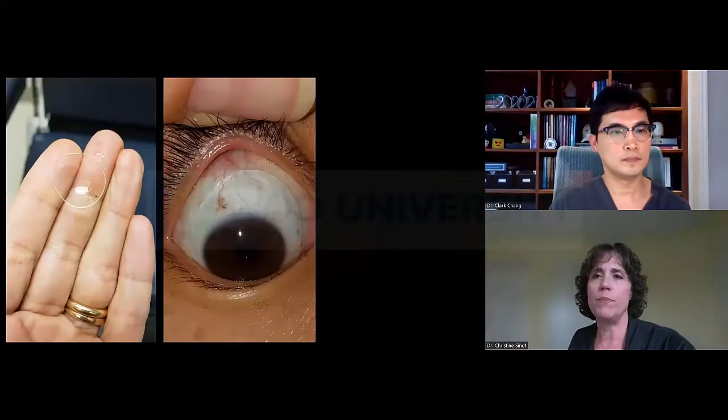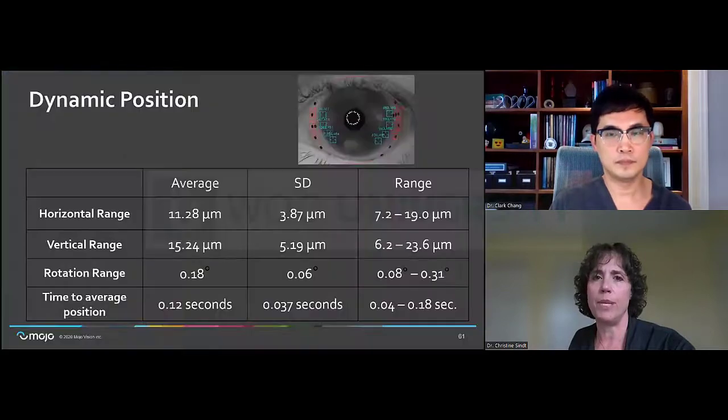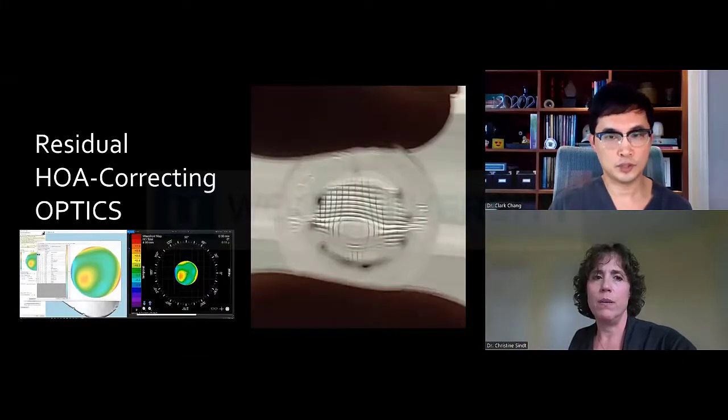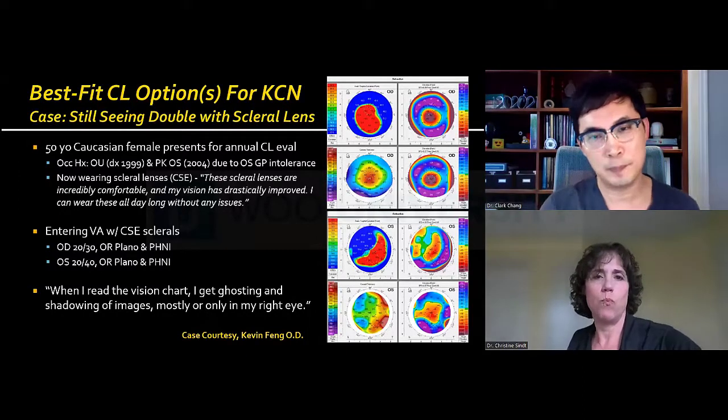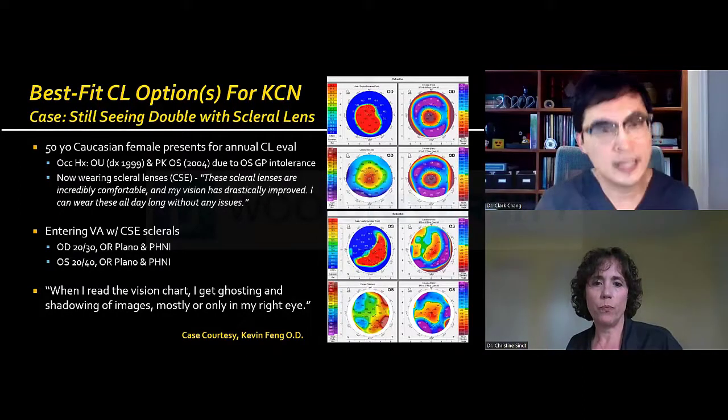I think you want to touch a little bit on some of the higher order optics for keratoconic patients. Sure. Yeah, so here's a case that I worked on with my resident, Dr.